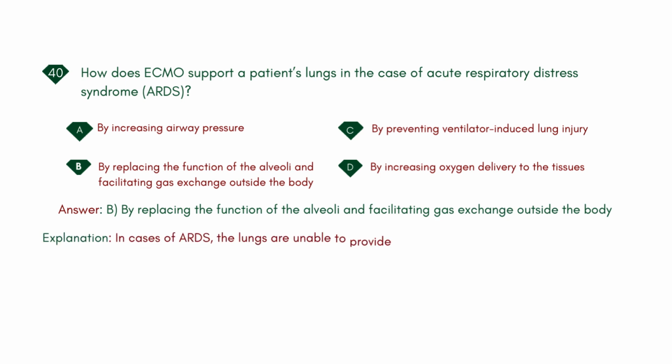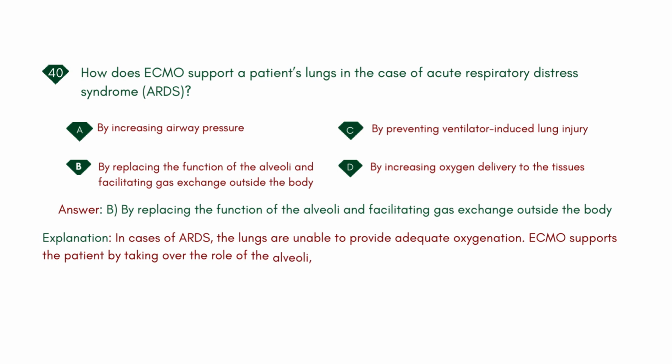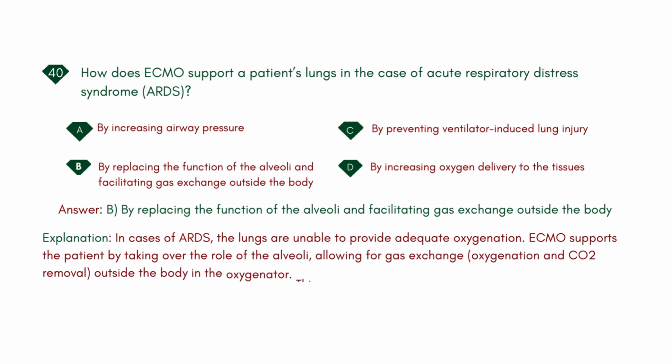Explanation: in cases of ARDS, the lungs are unable to provide adequate oxygenation. ECMO supports the patient by taking over the role of the alveoli, allowing for gas exchange, oxygenation and CO2 removal, outside the body in the oxygenator. This gives the lungs time to recover while oxygenating the body.